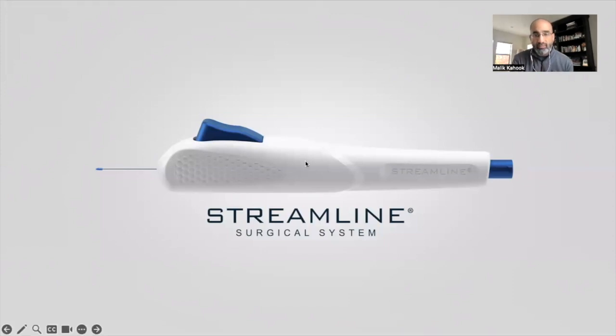So this is a handheld device with a port at the backside. This is the Luer lock where viscoelastic can be attached, either a cohesive or a dispersive viscoelastic, and you can read the label as to what has been tested with this device. It is instilled into the device until you see some viscoelastic coming out of the tip. The tip is then introduced into the angle, and I'll show both animation and live recordings of the device being used. Once that's in place and abutting the trabecular meshwork, the button is then depressed and you'll see the action of the device. So let's show that in a little bit more detail.